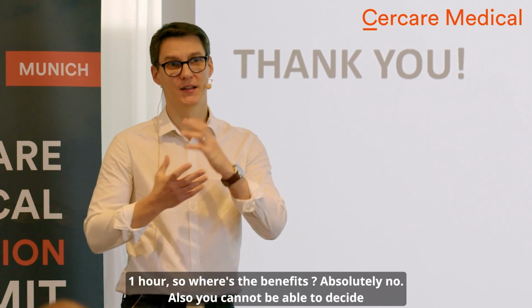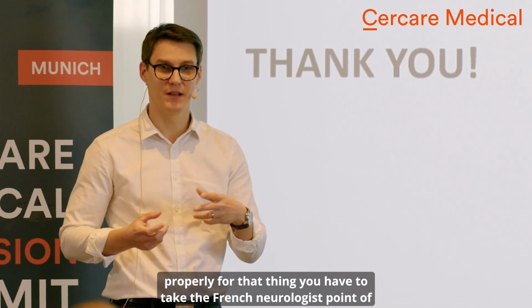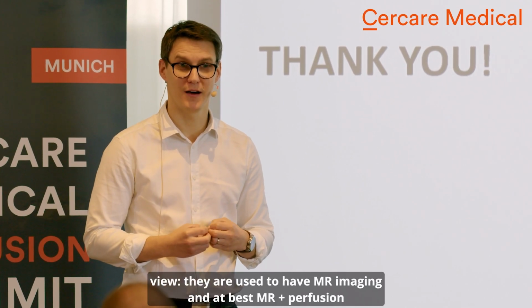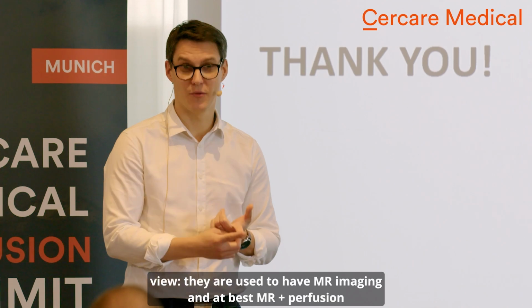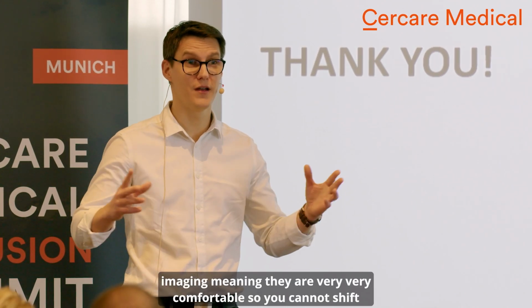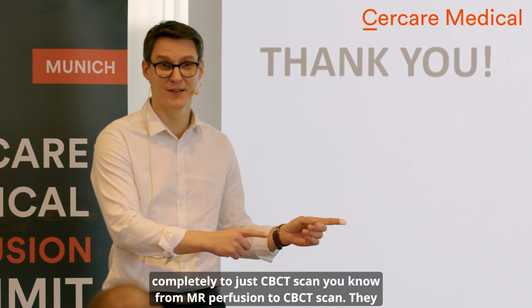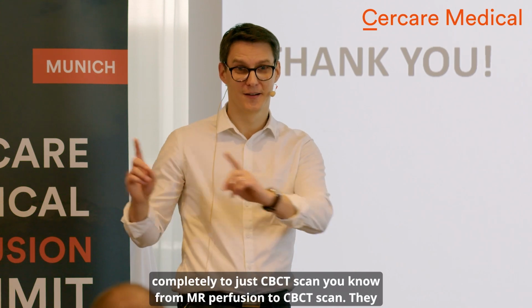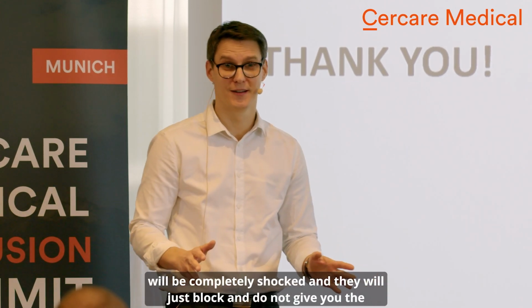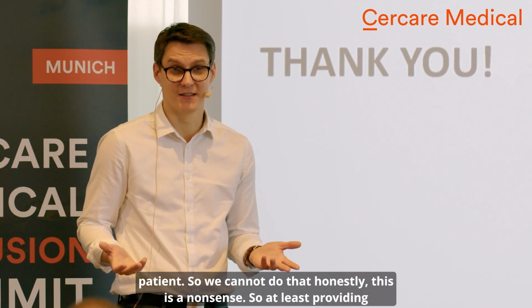Also, you will not be able to decide properly. Alors, for that, you have to take the French neurologist's point of view. They are used to having MR imaging and at best MR plus perfusion imaging, meaning they are very, very comfortable. So you cannot shift completely from MR perfusion to just a CBCT scan. They will be completely shocked and they will just block and not give you the patient. So we cannot do that, honestly.